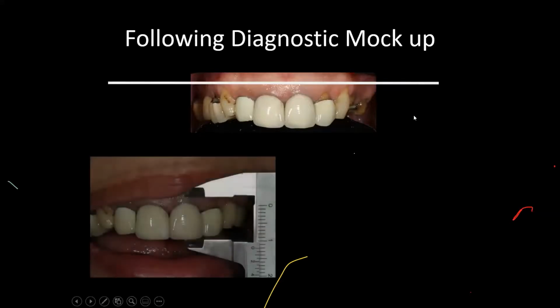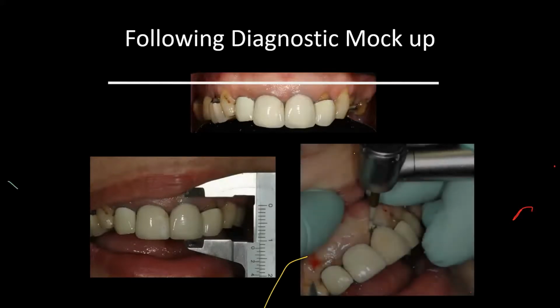And then you measure by reducing the teeth. So I'll reduce some of the teeth, and then you know how much gum recontouring you need to do. So I use, for instance, an NTI burr. Please don't try this if you haven't done this. We teach this at the college. This is part of the important armamentarium that we teach at the college, how to do this properly. And you go through a course when we do the perioplastic, something in module 6.